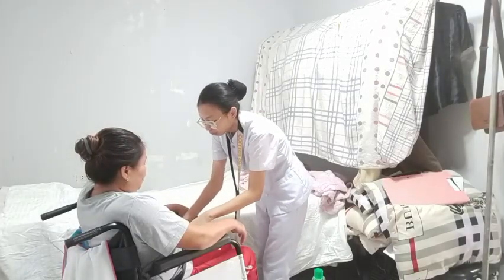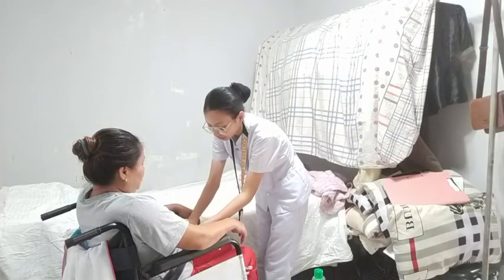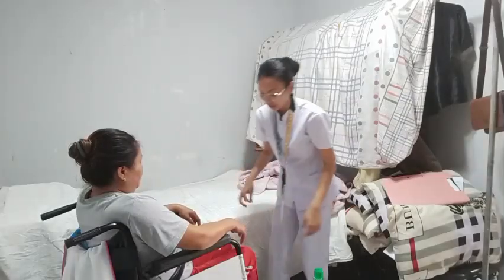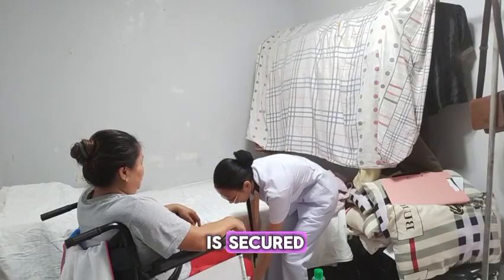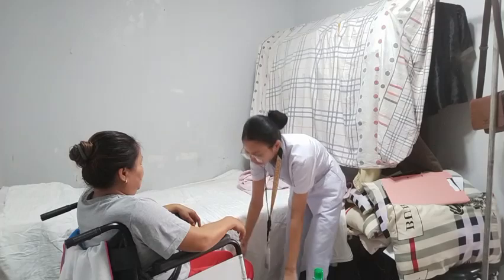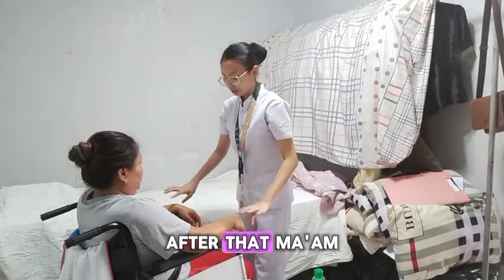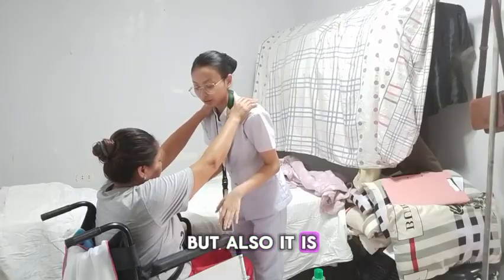After putting on the gait belt, make sure it is secured. And make sure their feet are touching the floor. Okay, now. After that, ma'am, I would like to put my arms here, but it is also optional.